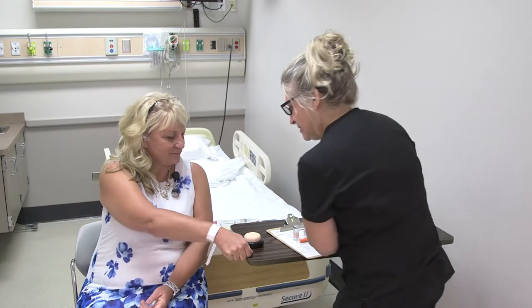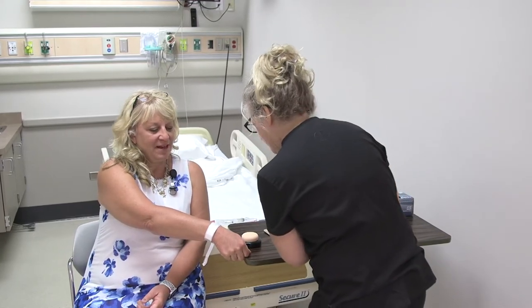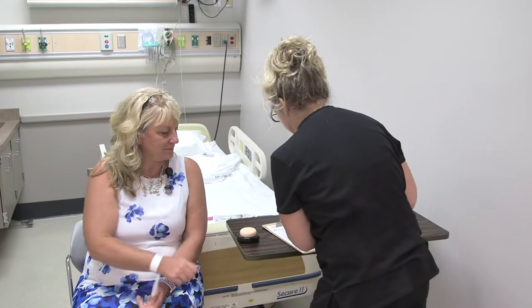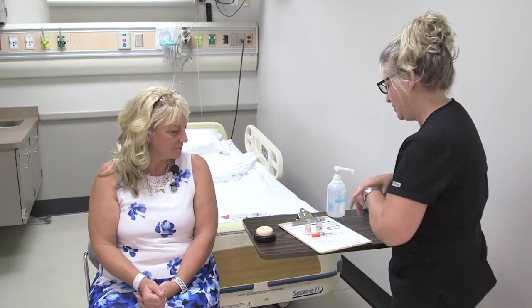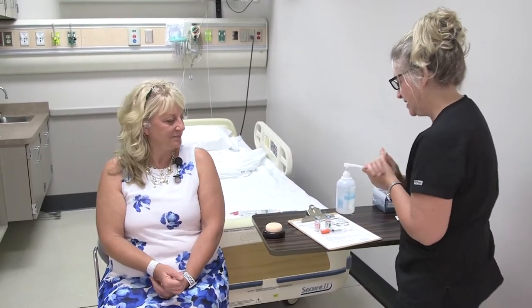Can I just have your name and date of birth please? Sylvia Vasquez, 1-30-1966. Excellent. That matches my MAR. And do you have any allergies that I should be aware of? No. Okay, perfect.